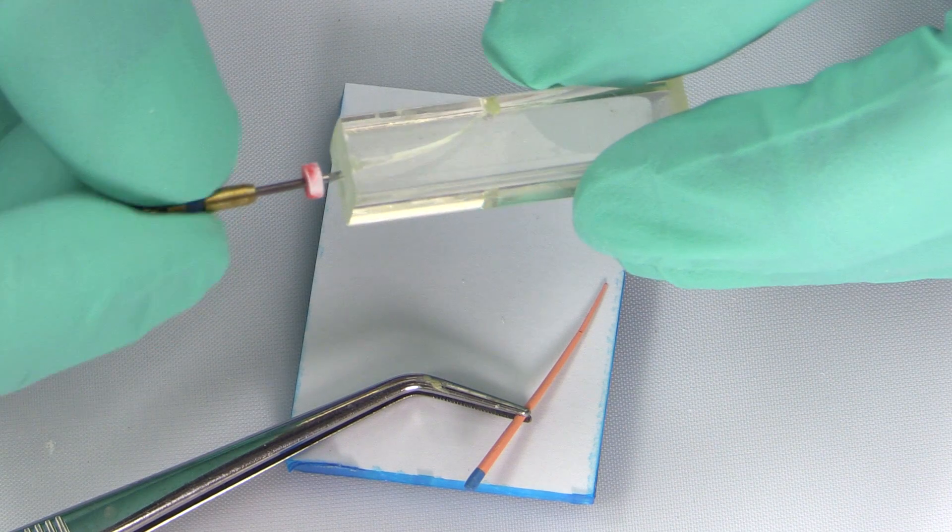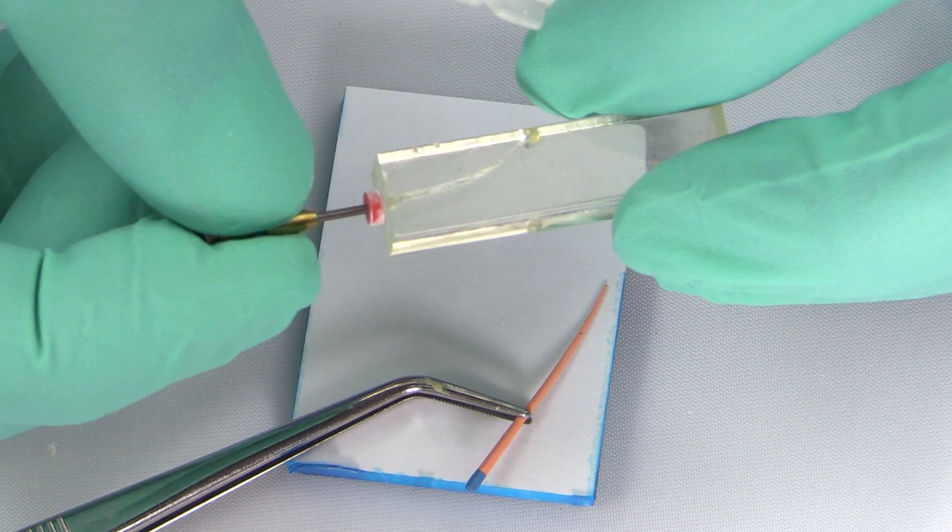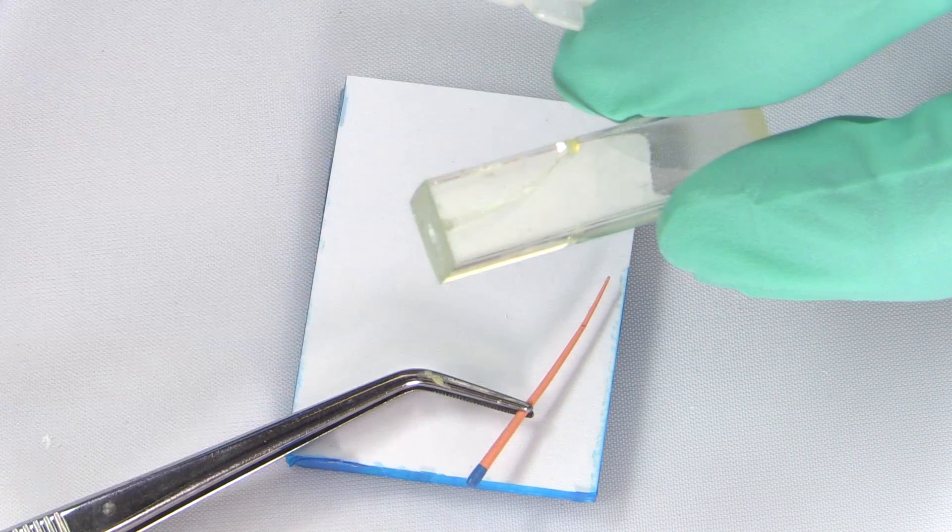It's important to make sure that your file is clean, which is why I recommend that after you've completed the instrumentation and fitted your master cone, you submerge the master file and master cone into full strength bleach for about a minute to clean the surface. After you have a clean master file and have dried the canal, you coat the master file with the sealer and then proceed to coat the canal walls by manually seating this file to the full working length. Some counter-clockwise rotation by hand is recommended at this time to help spread the sealer evenly against the root canal walls.